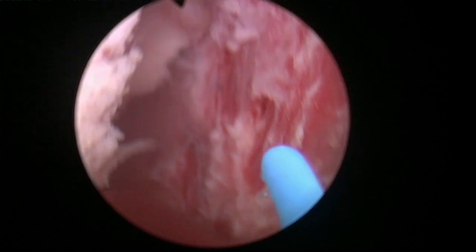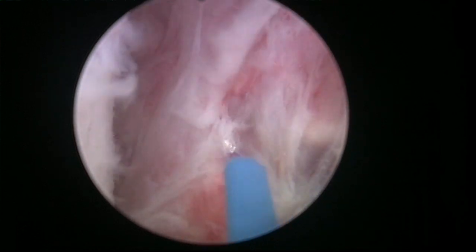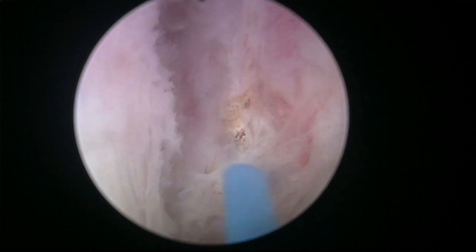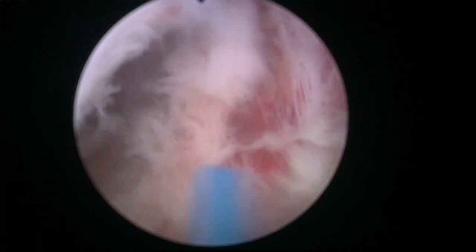So now I'm going to try to do hemostasis, because you see, while we maintain a nice laminar flow in this space, because we can see the capsule, we can have good visibility, and we can carry on our hemostasis. If you push the adenoma in the bladder, then the flow inside the fossa is very chaotic, which means that there will be blood everywhere. You cannot flush it so easily. So it's nice, before turning the adenoma into the bladder, flipping it, you can do your hemostasis here.